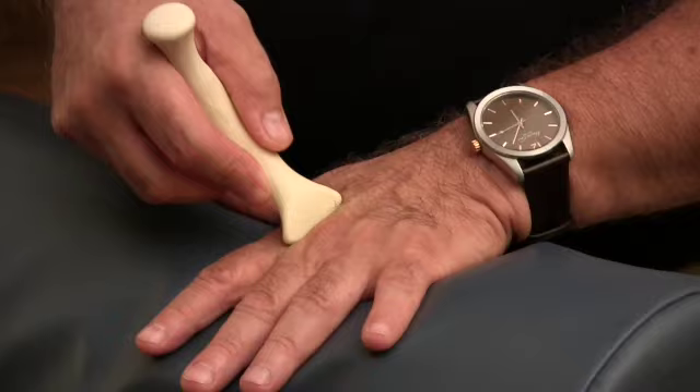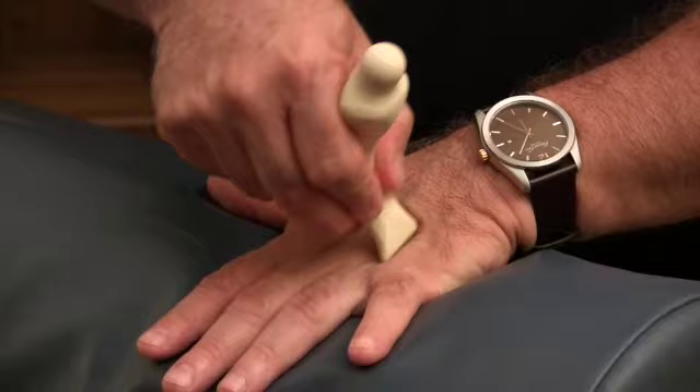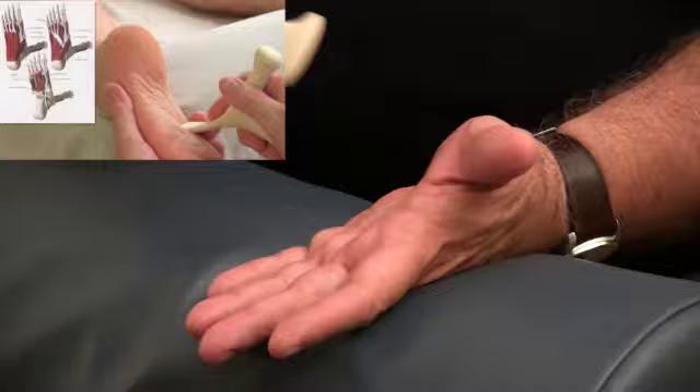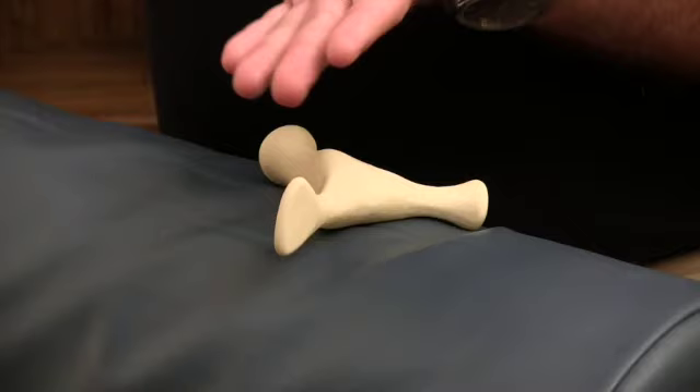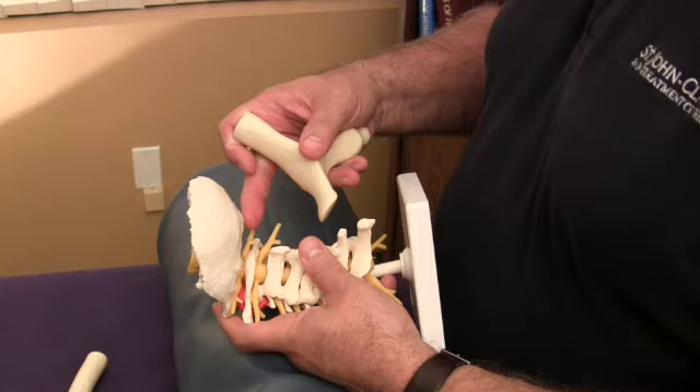Both of these tools are excellent for doing this. This particular tool — and you can use this on the feet as well, you can use it on the palm of the hands. This is also wonderful for going down the lamina groove in the cervical area. It fits right in the lamina groove and was designed to fit around the occiput, where you would have the suboccipital muscles.